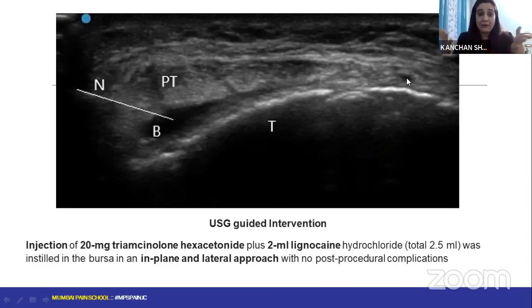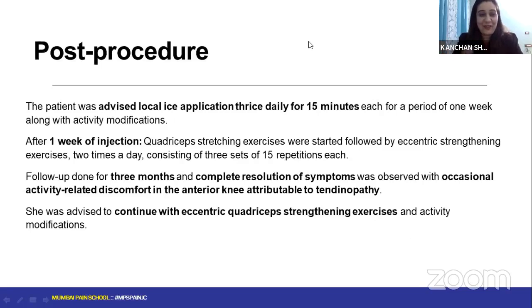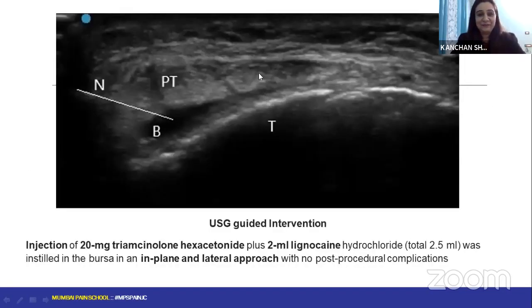And it might be a complete one, where you have a connection from the deep patellar region going towards the skin, the tract itself. To see the tract, you have to do dynamic scanning. That is not being done here. So that is also there. And the drug, obviously, you have said. So that's all from my side. I think that's all I can add.